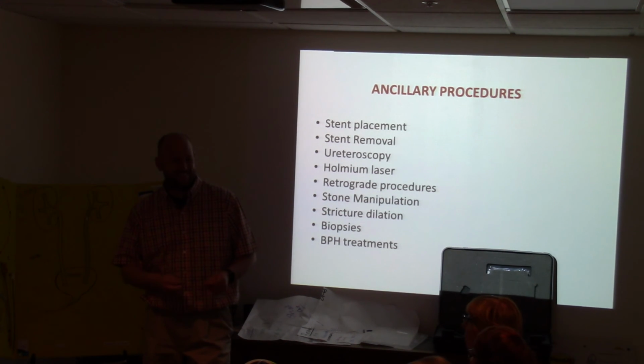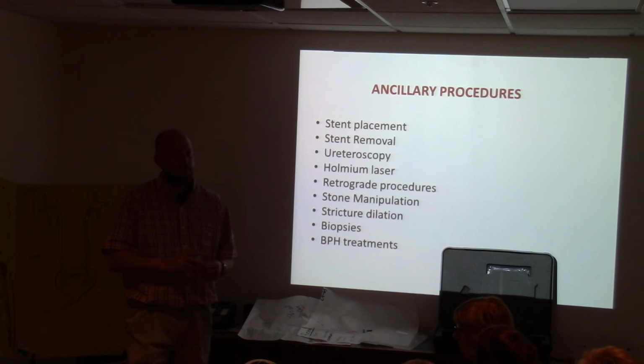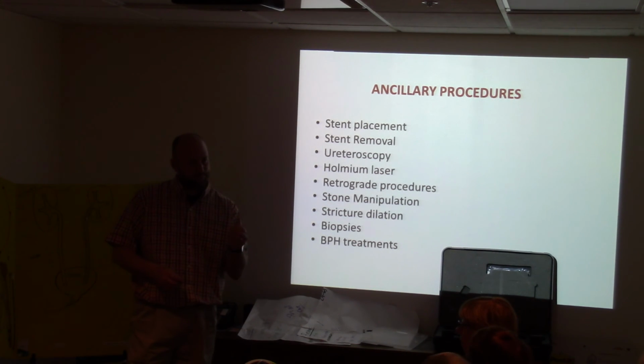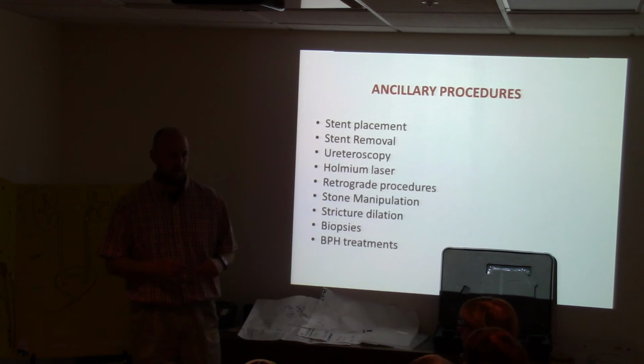Multitask. So for holmium on the mobile side, they use the ureteroscope of the facility to get the laser, because the fiber has to be fitted. It looks like a wire. I was surprised to see how the holmium fiber looks. I knew they were flexible. So they have to fit it to the ureteroscope. When we go on a mobile basis to do holmium lasers, the hospital has all the scopes, everything. We bring the holmium machine and the fiber.